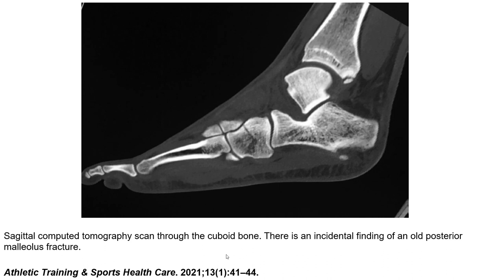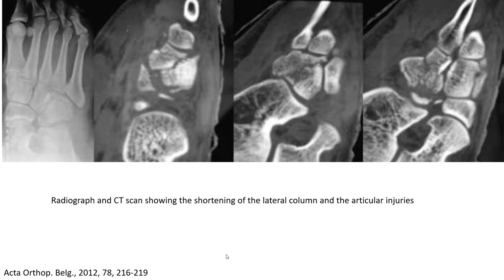This is an example of a cuboid fracture on CT, demonstrating comminuted fragmentation of the cuboid bone.